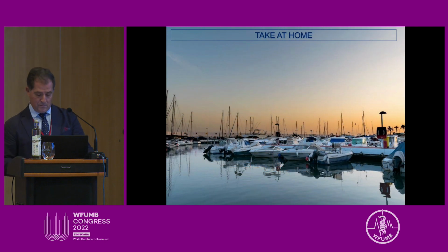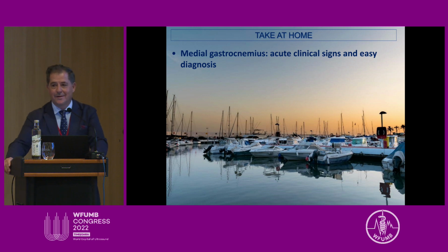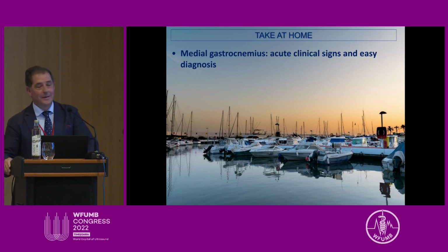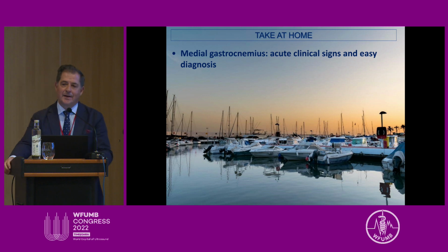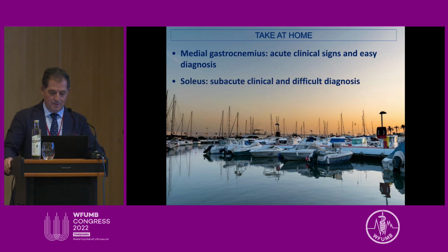Finally, only three details. The medial gastrocnemius is very easy to diagnose. The ultrasound, or better, the clinical sign is very clear. But in the other case, the soleus presents a subacute clinical sign, and the diagnosis is sometimes very hard.